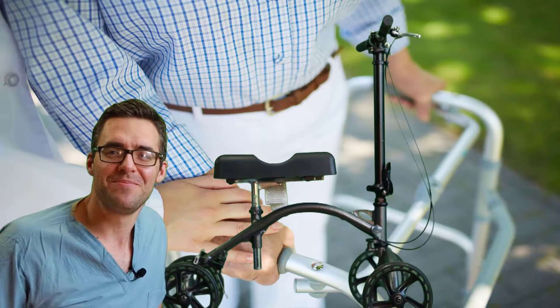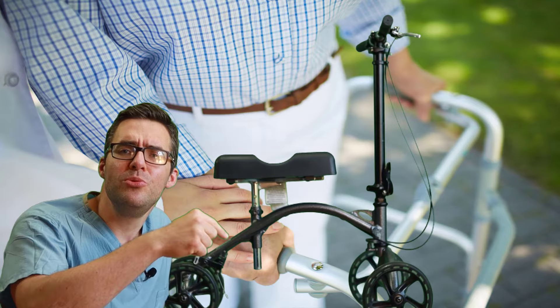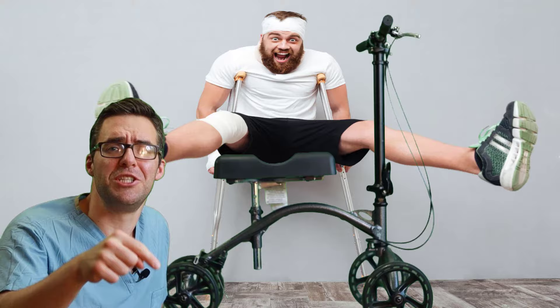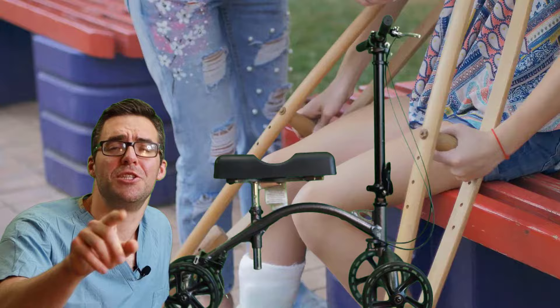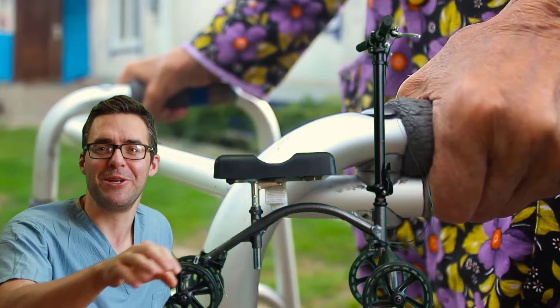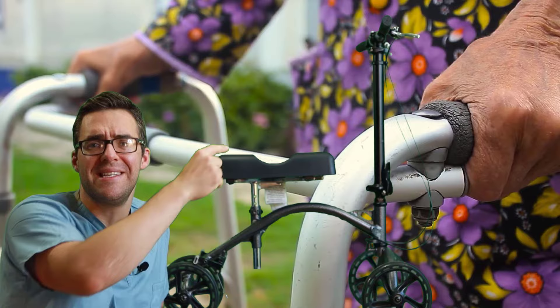When you're indoors, use a walker. Don't use the knee scooter indoors — it's tough to get around stairs and different levels. Inside, use crutches or a walker. Use the scooter for outside and parking lots. Personally, I hate crutches — they kill your armpits. A walker indoors for short spaces, and the knee scooter for outside spaces, really makes a big difference.